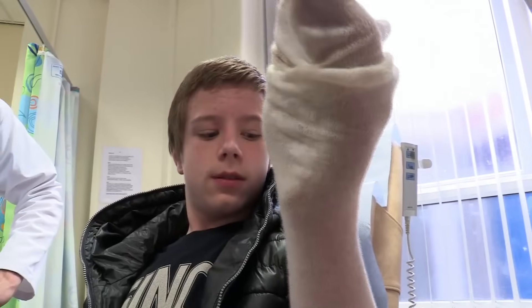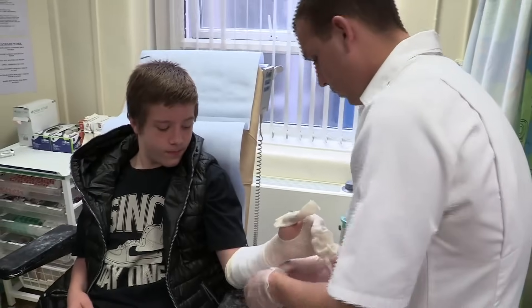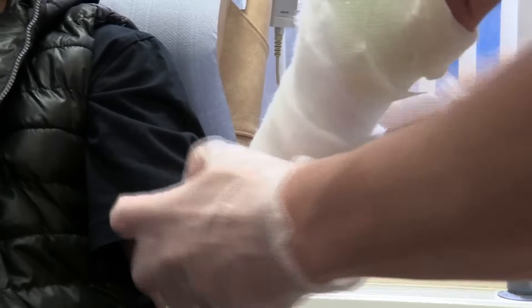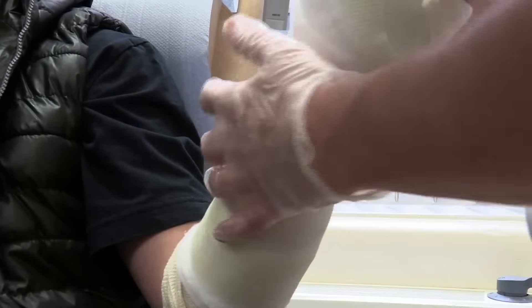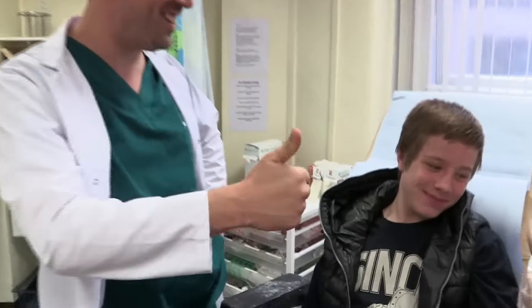When you get a cast like Jack, first a sock goes on to stop the cast itching, then a layer of cotton wool padding, and finally a layer of plaster which sets super quick into a hard shell.